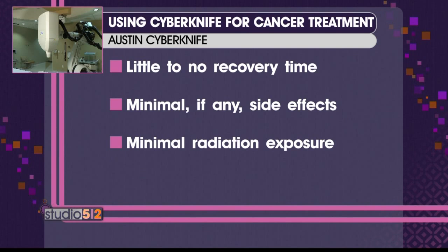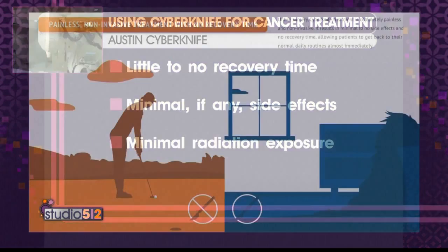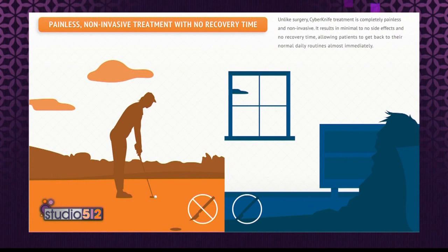You mentioned there are cancer patients as well as people with other situations that are treated. What are some of those different causes for treatment? Yeah, so many different cancers to different parts of the body, and also conditions where there's no cancer. For example, trigeminal neuralgia is a nerve pain in the face. And by targeting the nerve, the pain can go away completely in severe cases. There also are things growing in the brain. They're not cancer, but they compress organs, and CyberKnife is a very effective treatment for those too.